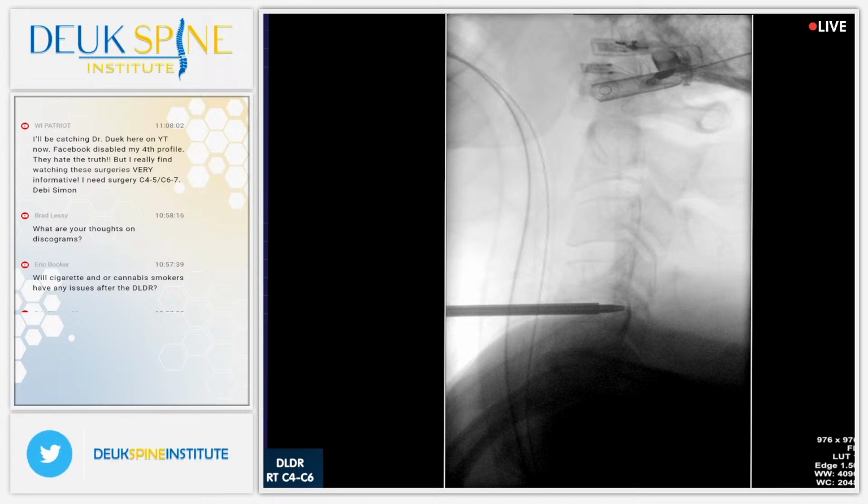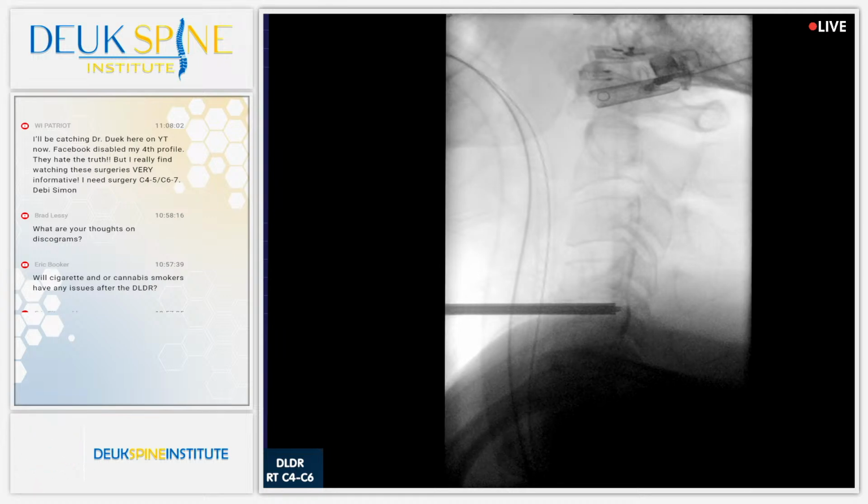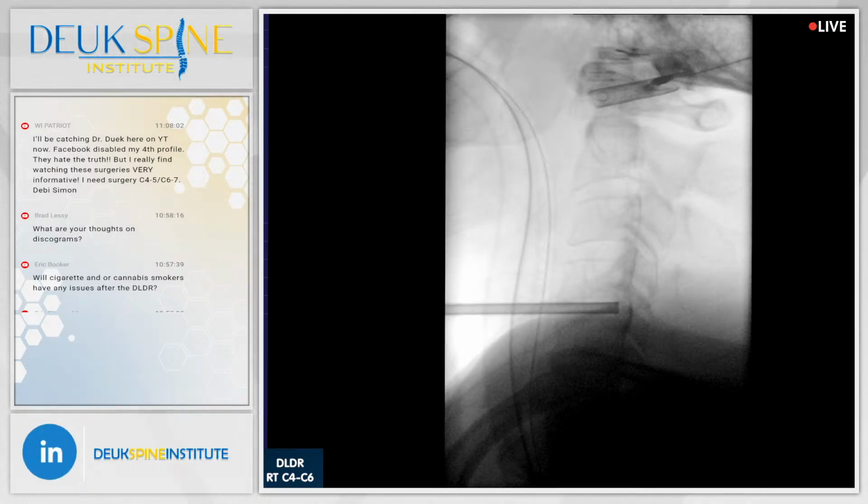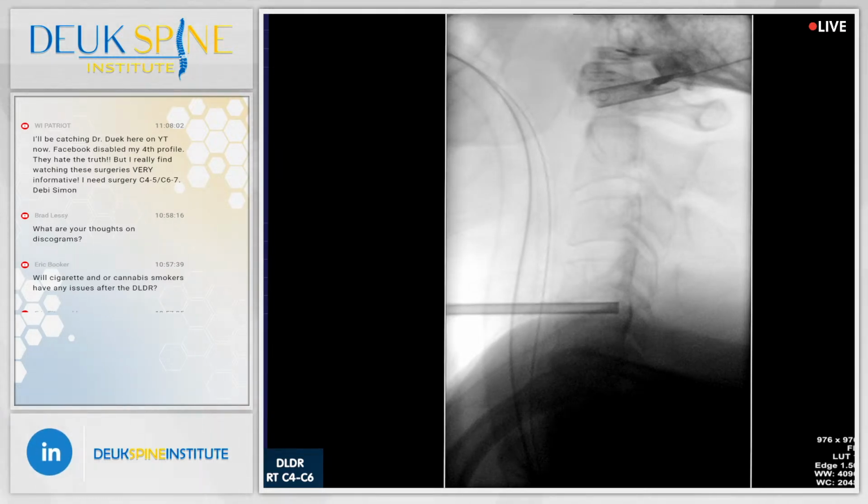Shot. All right. Let's hope it stays there. That's pretty good right there. I like that. Let's see. Try to keep it there. And shot. All right, that's good.